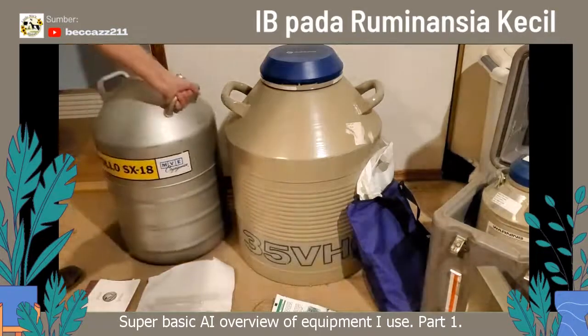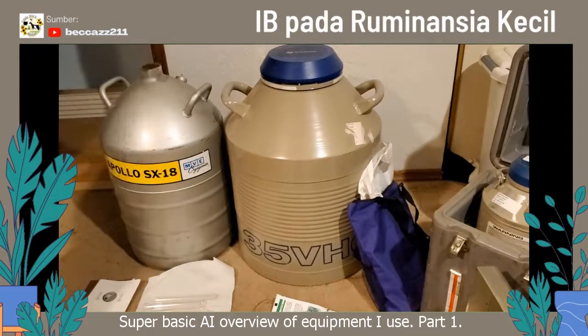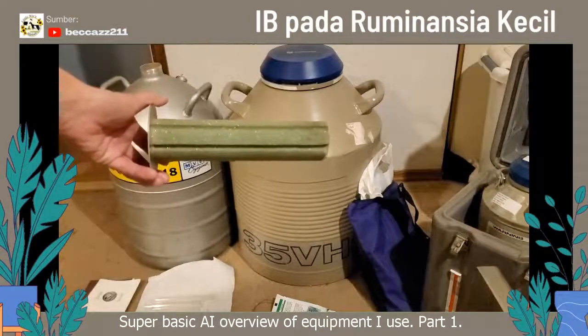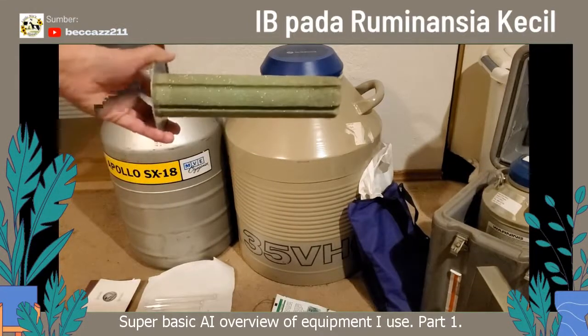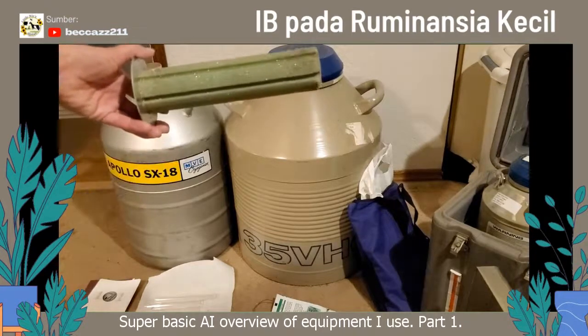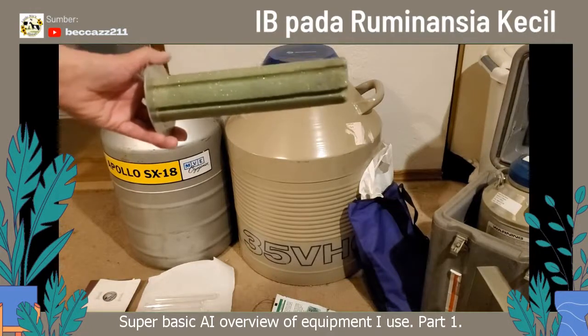Another tank here is an older one. It's an Apollo SX-18, which was the original — became the MVE 2020. This tank is dry. I'm going to show you some of the components here. That is the fork. You'll notice that it has grooves in there for canisters.